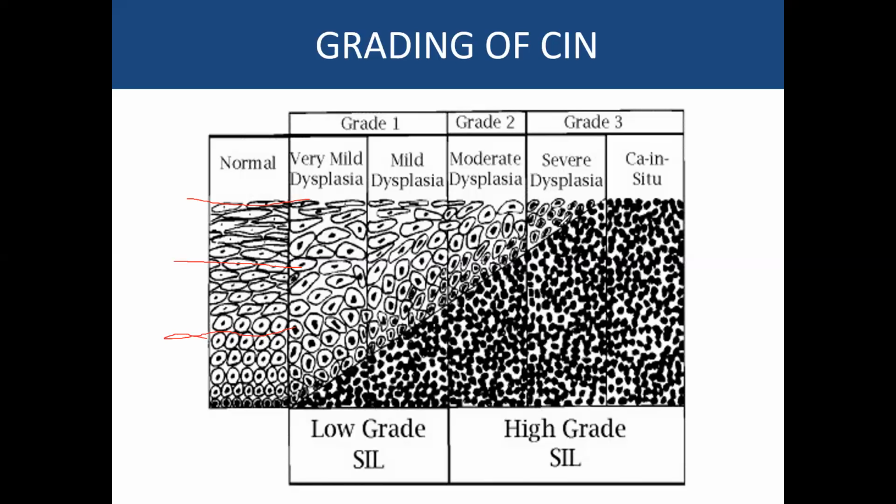But in severe dysplasia, you see you still have some small differentiation here. You see here, all these cells, no differentiation. So where you have the undifferentiated neoplasm covering up to 1/3 is mild dysplasia. Where they cross from the mild all the way here is called moderate. Once they cross this line, the second line into the 3rd area, then we say it's severe. But with severe, you still see some degree of differentiation. So they cross up to 3rd, not the full.